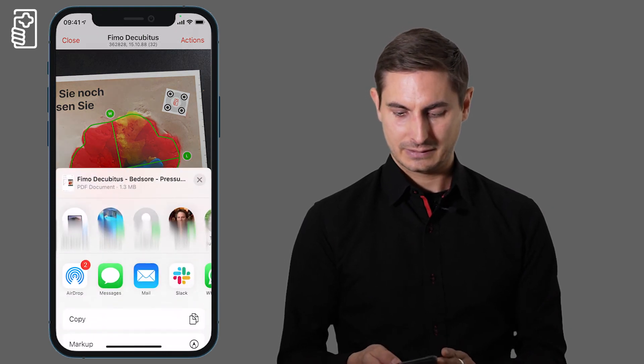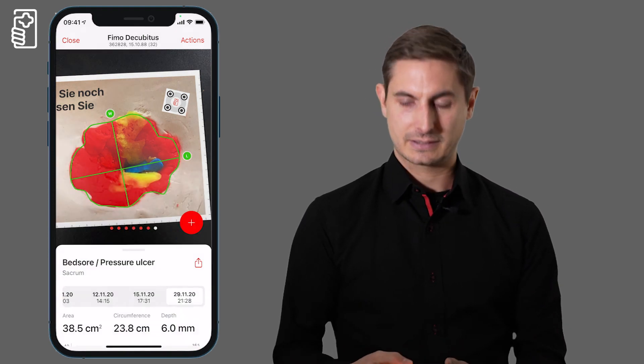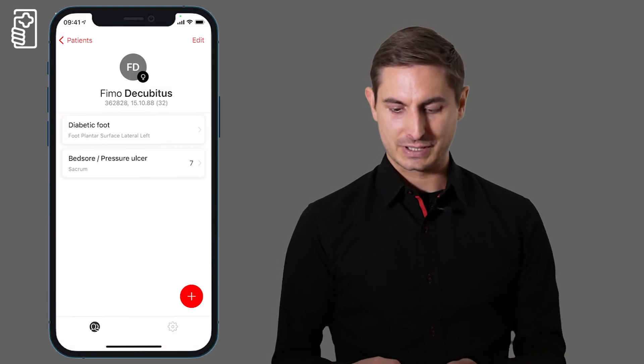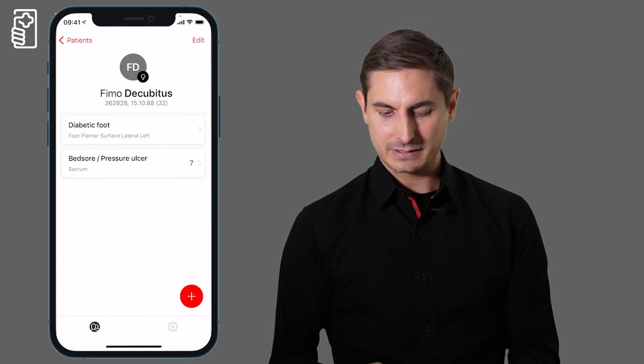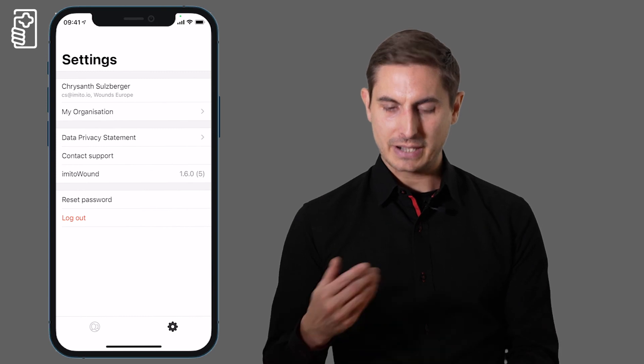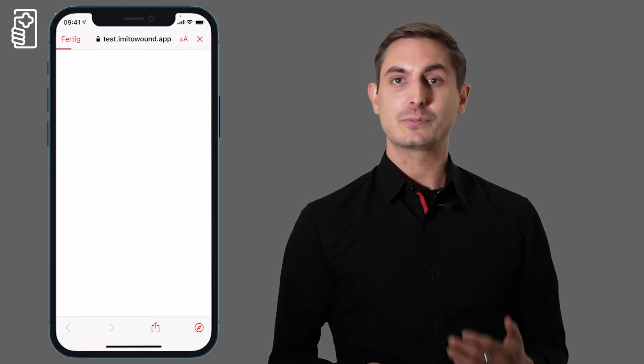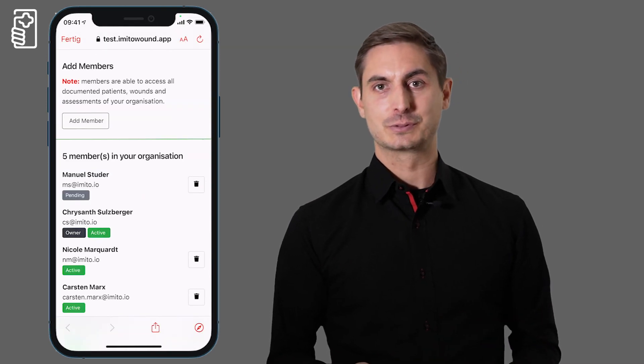And as the owner of an organization in the settings we can also manage the organization and invite other colleagues to Imito Wound. So it is designed for small teams to start using it immediately.